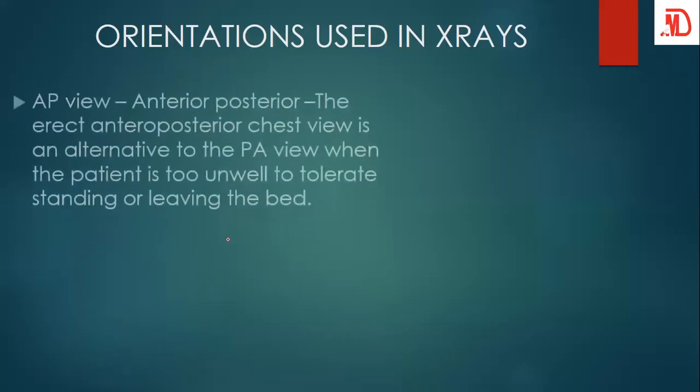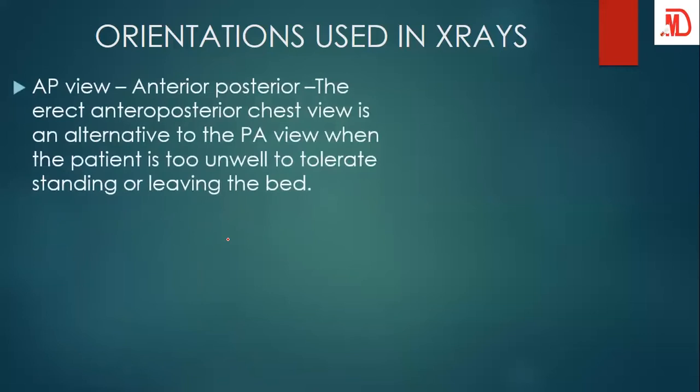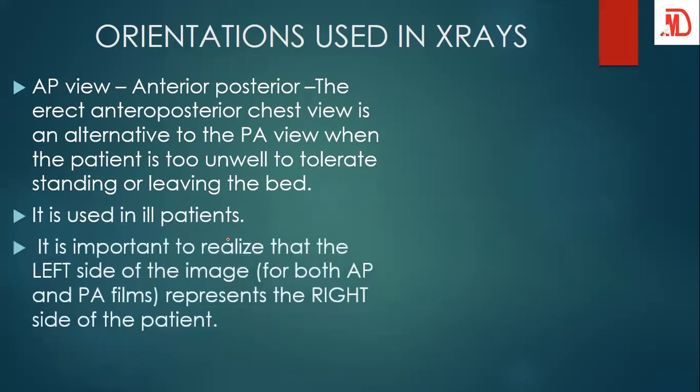So what are the other alternatives? We have the AP view. Like I said, if the patient is too unwell to stand, then we'll go by the AP. It is used for very ill patients.